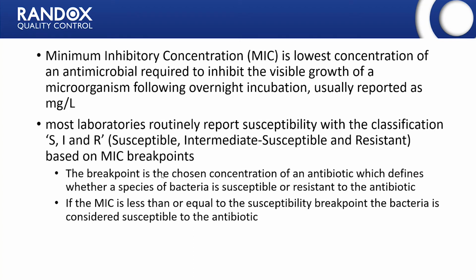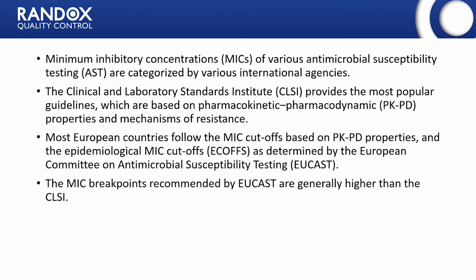The breakpoint is the chosen concentration of an antibiotic which defines whether a species of bacteria is susceptible or resistant to the antibiotic. If the MIC is less than or equal to this breakpoint, then the bacteria is considered susceptible to the antibiotic. These breakpoints are categorized by various international agencies.